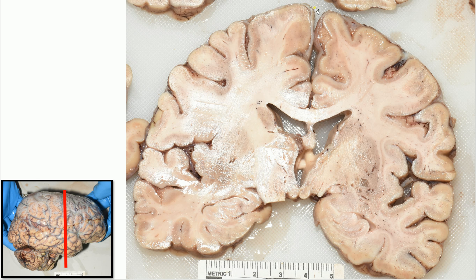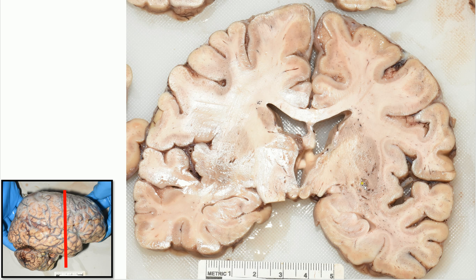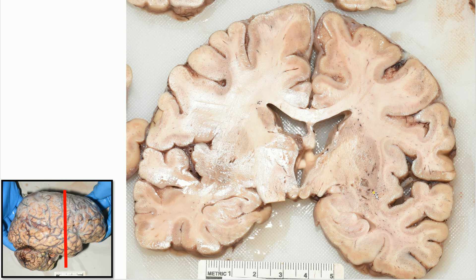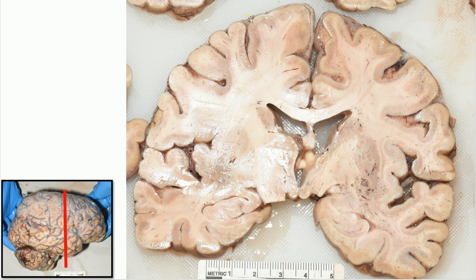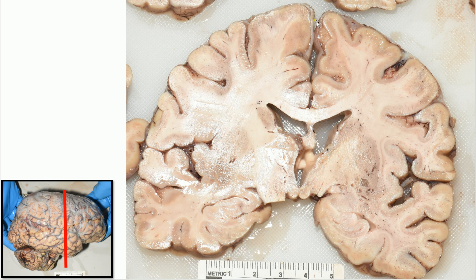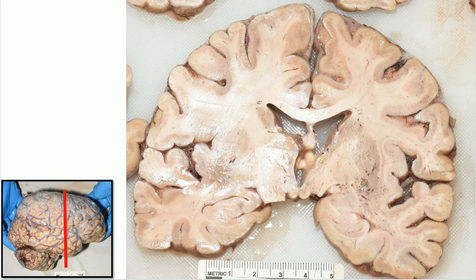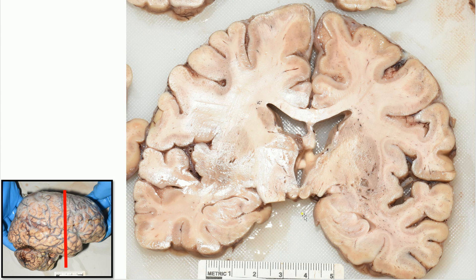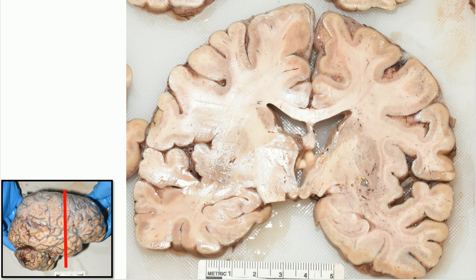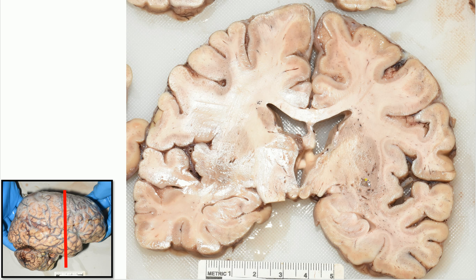In this section we can also see that in the inferior aspect of the putamen, there are these little cyst-like structures. That's very concerning, because if we just had the abnormality along the surface, I could say that's a meningitis — specifically a leptomeningitis. But having these alterations in the deep tissue makes me worried about an encephalitis. There are a lot of things that can cause meningitis — infection is a major one, but chemical meningitis and other causes exist as well. Here, the meningitis combined with involvement of the brain tissue looks like an encephalitis.